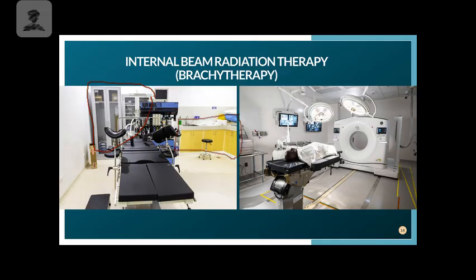It just depends on what your facility offers space-wise and also what the physicians need to get the exam done. Over on the right-hand side, this to me looks more like a surgical suite because it reminds me of it with the ceiling mounted lights, where the physician can reach up and grab this little handle here and maneuver that light so that they can see better. They do have a mannequin on this table, and what's interesting about this one is that it is a suite that has a built-in CT.